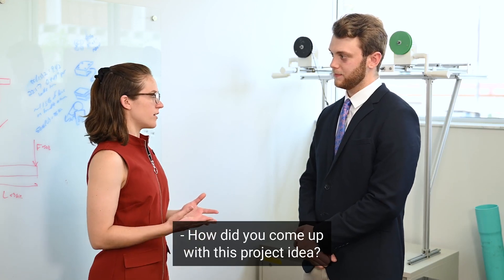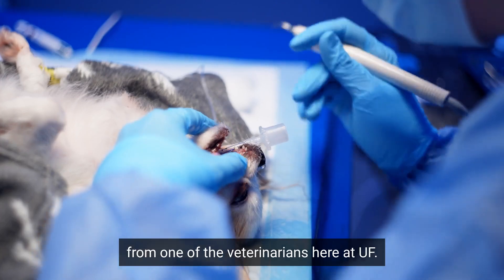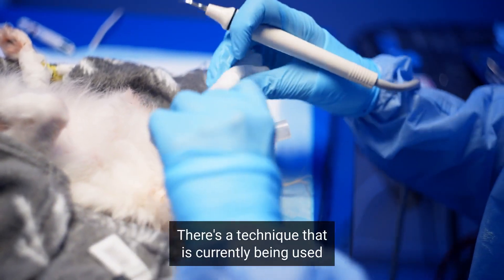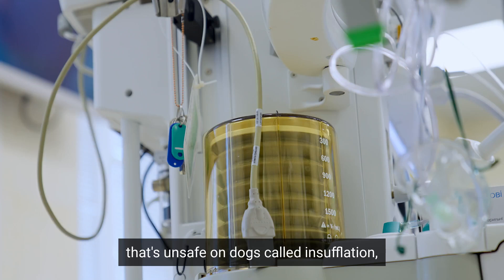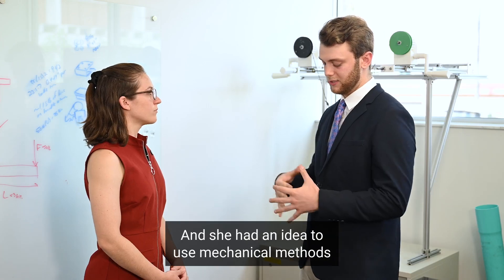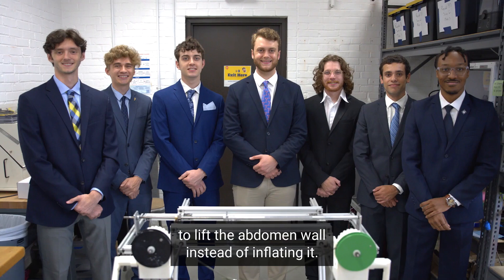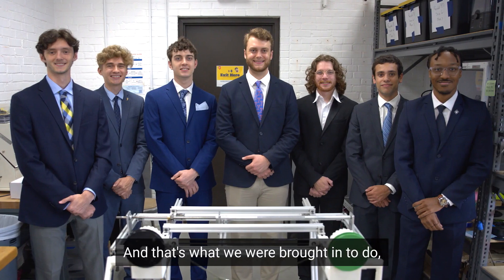How did you come up with this project idea? We were given the problem statement from one of the veterinarians here at UF. There's a technique currently being used that's unsafe on dogs called insufflation, where they inflate the abdomen of the dog to get enough room for the surgical devices. She had an idea to use mechanical methods to lift the abdomen wall instead of inflating it, and that's what we were brought in to do — the mechanical side of things.